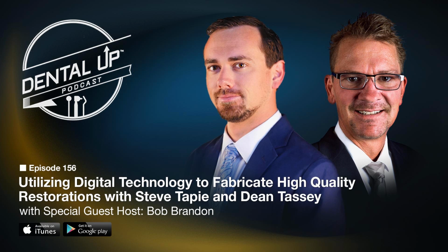Yeah, it's extremely low. Again, because we're cutting out what I've always thought were the two single largest sources of error. Number one, on the clinician side, was the impression taking procedure, and conversely on our side is pouring the impression. So it just eliminates the two largest sources of error and therefore improves the accuracy.